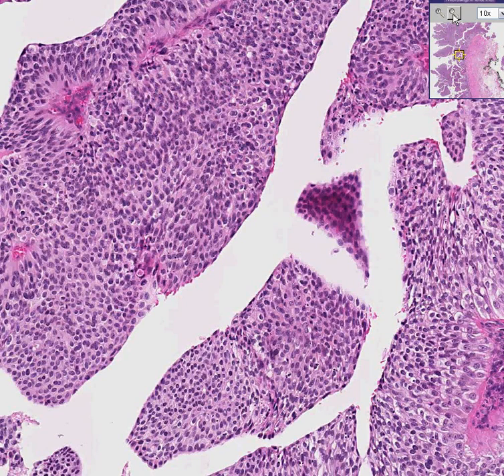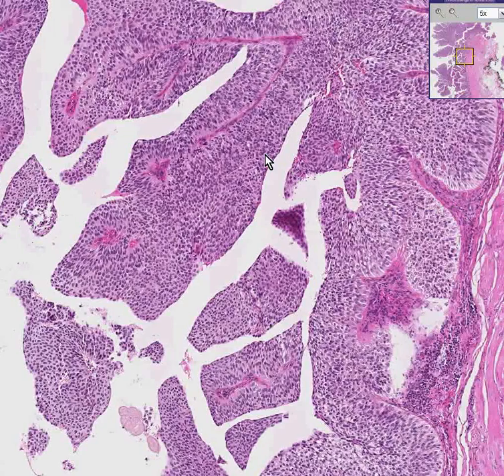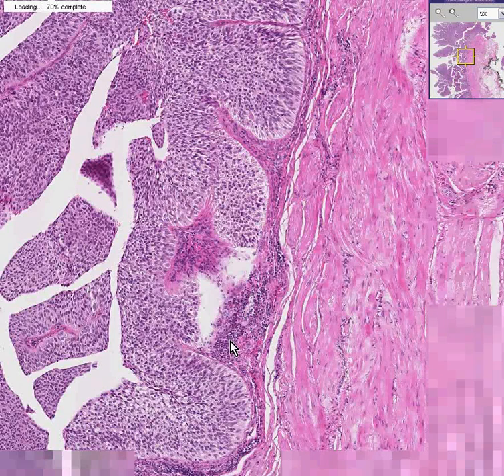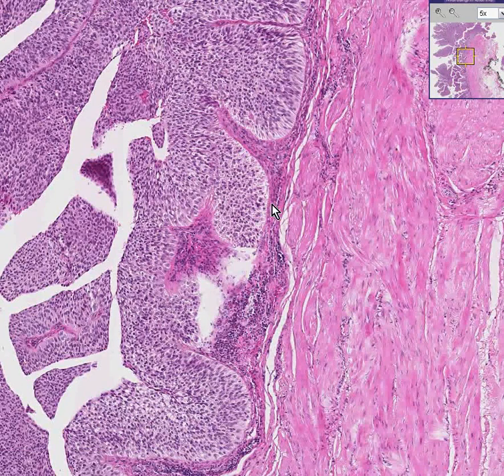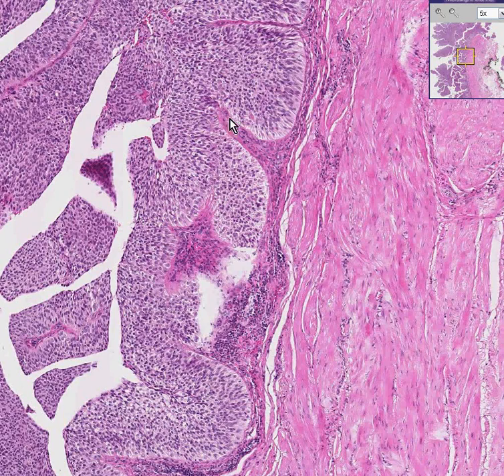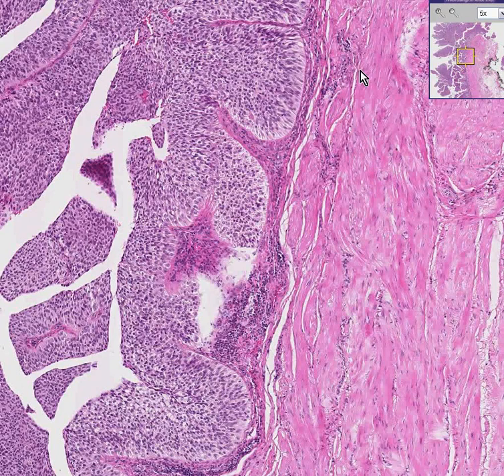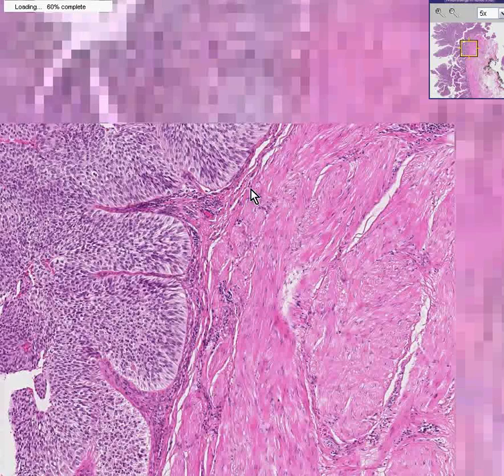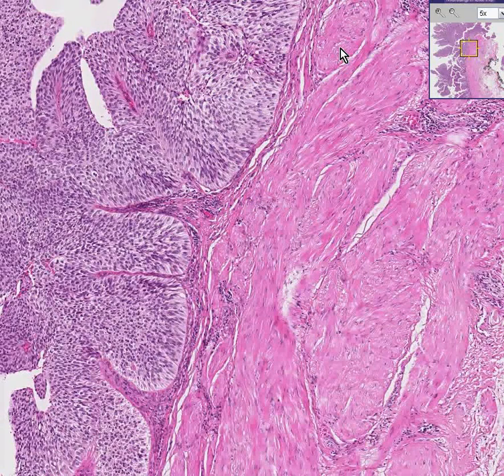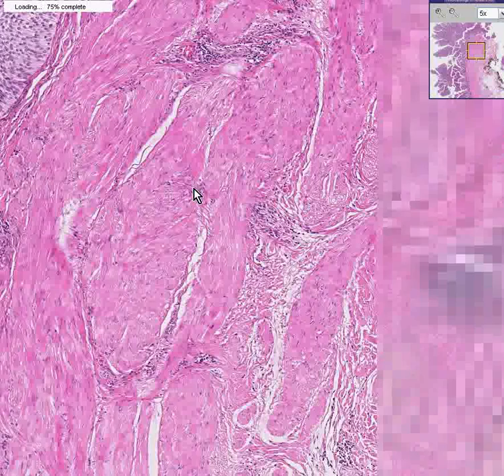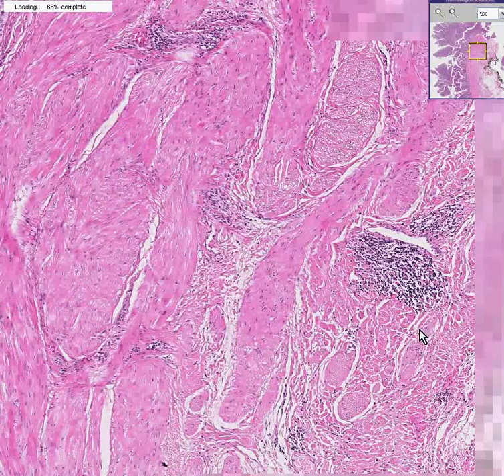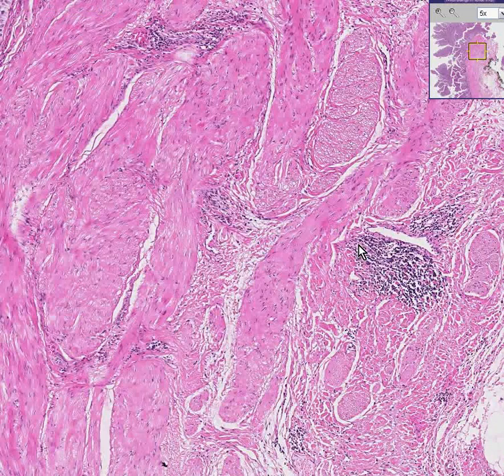Often, they can very diffusely infiltrate the underlying muscle. But in this case, they seem to have stopped short of it. Notice there are little collections of inflammatory cells here. Notice that some of the connective tissue extends into the tumor to form the fibrovascular core for these papillary structures. Notice, at least in this field here, that the underlying smooth muscle has not been infiltrated. Also notice that even though you can see clusters of inflammatory cells — lymphocytes in the wall — in what we've seen so far, there is no tumor invasion.